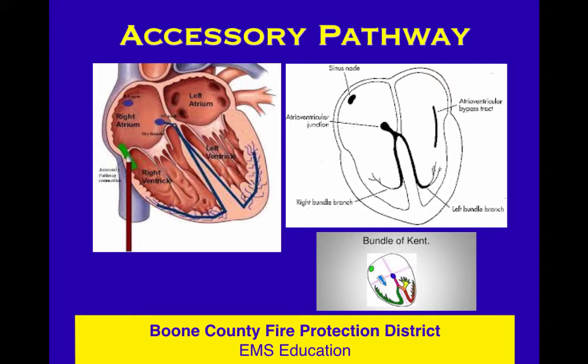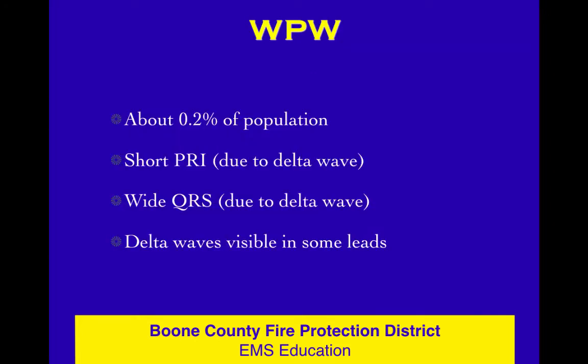The PRI is supposed to represent when the impulse is slowing through the AV node, the AV junction, the bundle, and the branches — it's supposed to be taking up some time there. But if that never gets to happen, the impulse just jumps straight across, and you're not going to have much PRI. So you have that slurred upstroke — that delta wave — and that's pretty much classic for an accessory pathway.